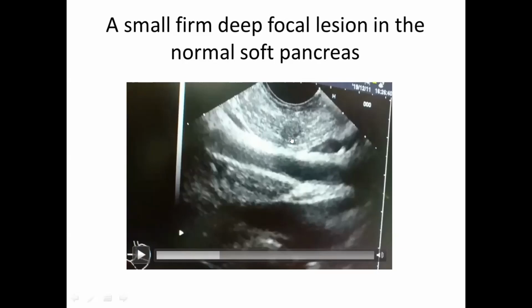But the real difficulty is that this lesion was very hard, and it is located in a normal healthy pancreas, which is soft. So when the needle approaches the upper aspect of the lesion, it is pushing the needle or shaking the needle and not moving through it.